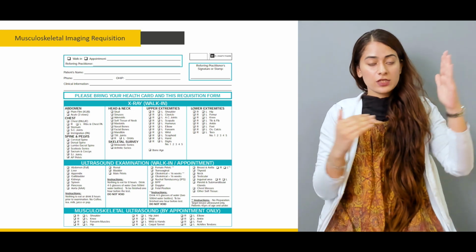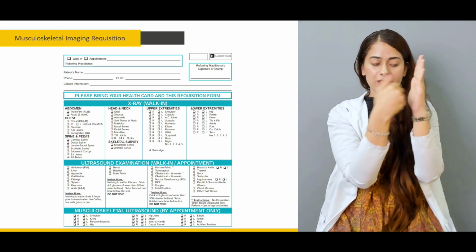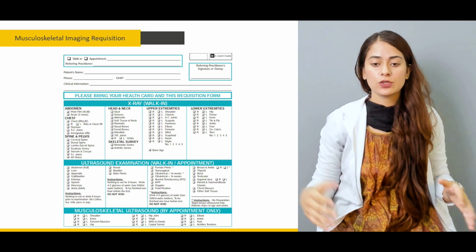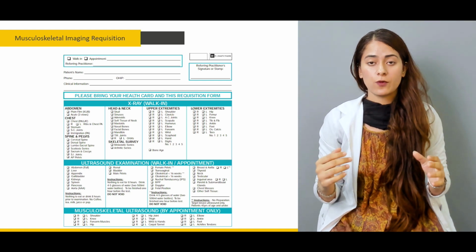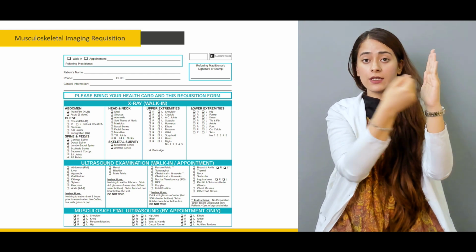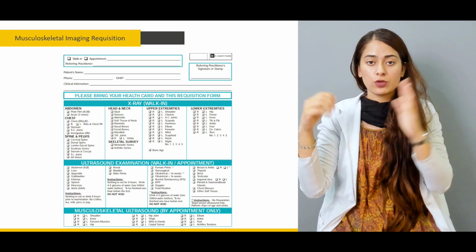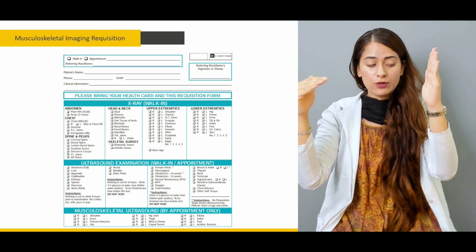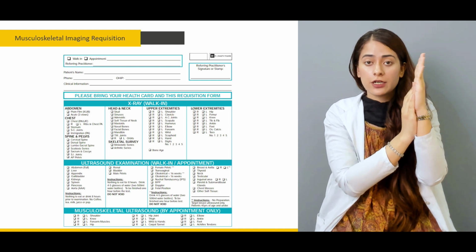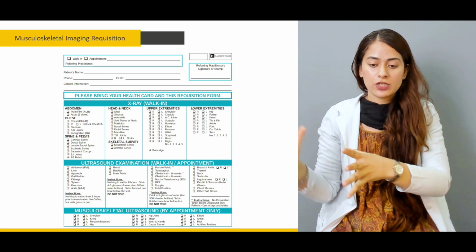So an X-ray image is formed when the X-rays actually pass through the body and are either absorbed by the body or fall on the cassette. So ultrasound images are formed when the sound waves hit the part which is to be viewed and they resonate. They come back to the probe, and the image is then formed.